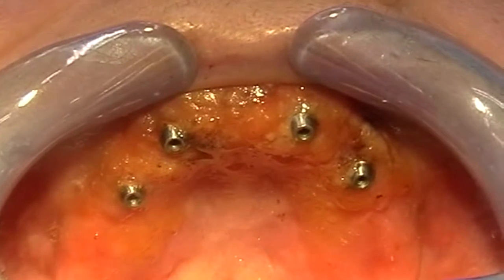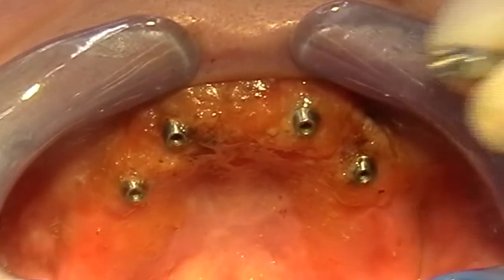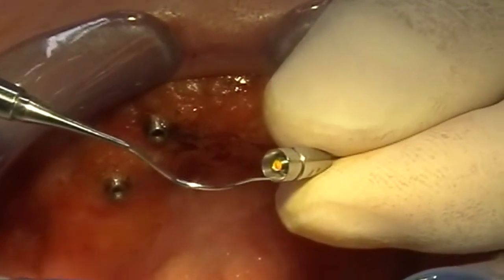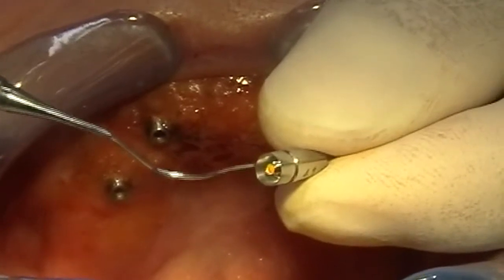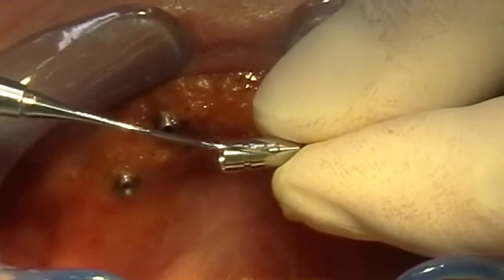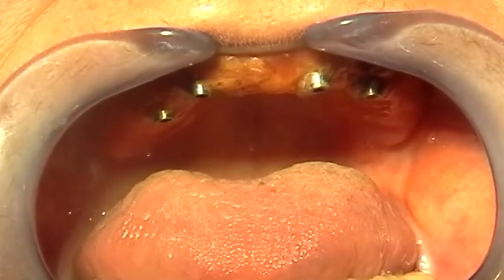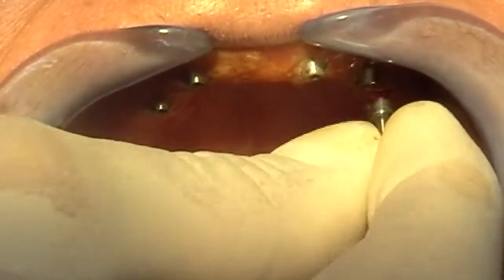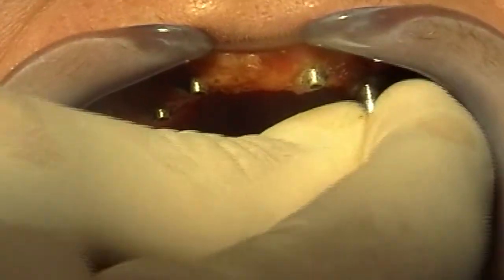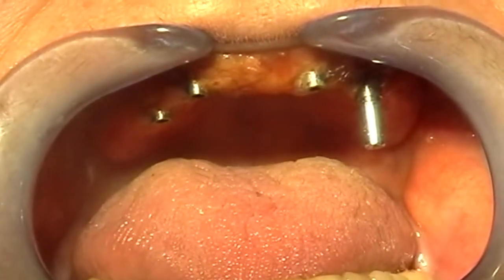As soon as the abutments are permanently connected we can acquire the position of the abutment in the mouth. To do so we use these transfers. The yellow color code indicates a diameter of 4.1 millimeters. The transfer is also laser marked. I screw the abutment onto the transfers all the way to the stop and hand tighten them.